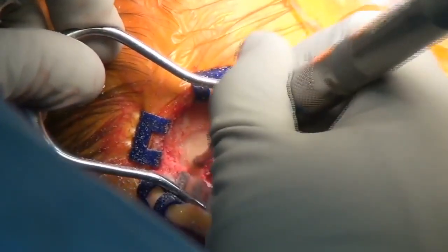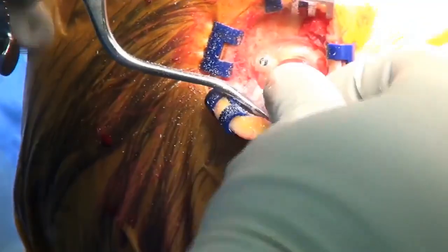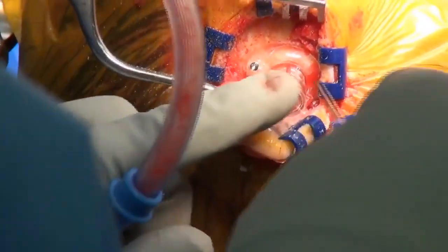Okay, so we're just drilling down the bone a little bit so that the little platform that we use isn't sticking up so much. There we go.